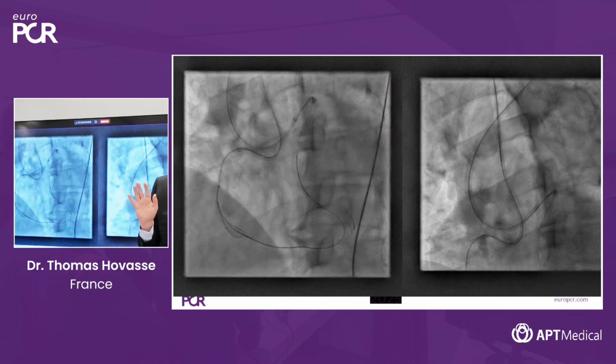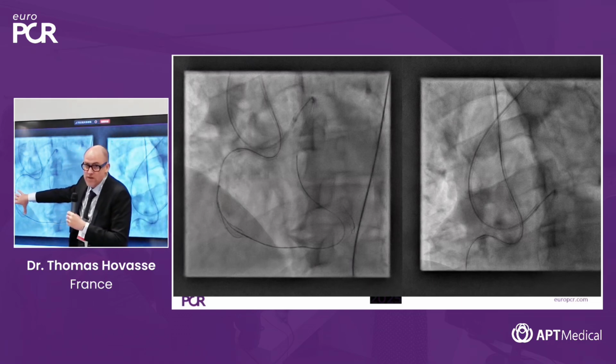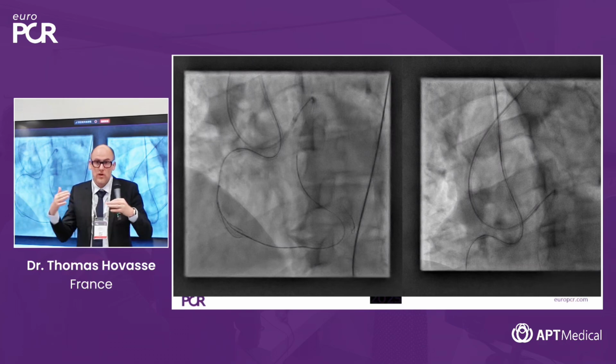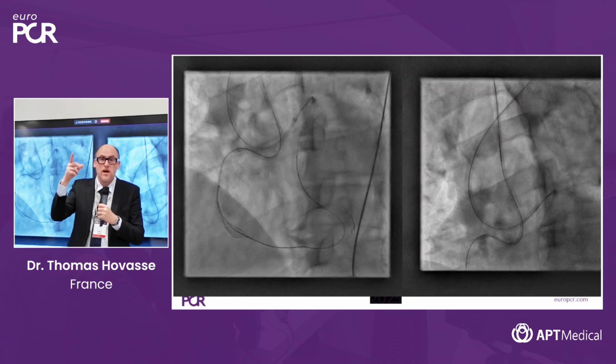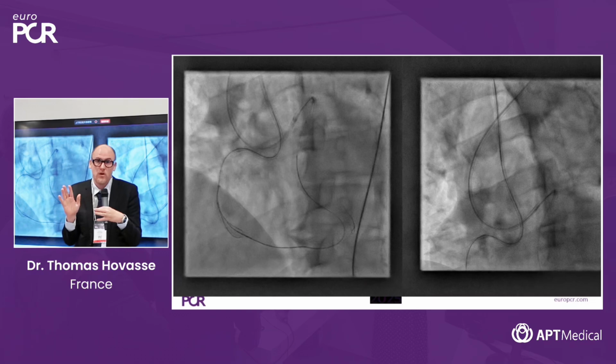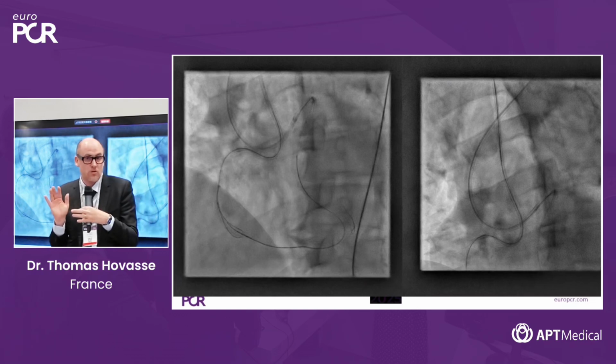It's not a problem. Imagine that here it's a gray zone. You don't know where you are. Maybe if you don't perform a knuckle and the two wires are in a good position, they can be either subintimal or intraplaque, antegradely or retrogradely. Here we performed a knuckle, so both wires went subintimal. It's not possible that they are intraplaque.